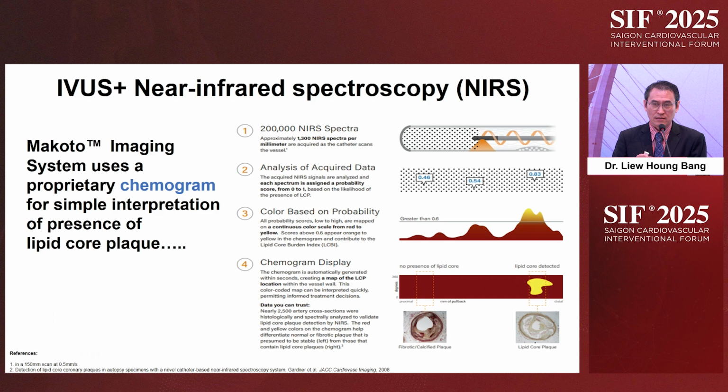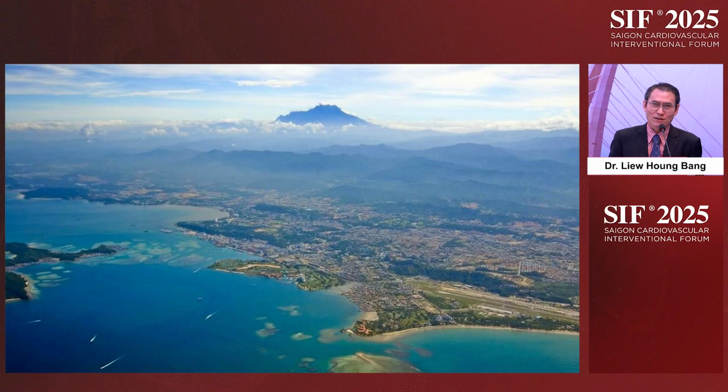It tells us about the arc of the plaque, whether it is circumferential, 90 degree, 180 degree. So it also tells us about the density of the plaque. And this is a concept which is new for us to grasp. And I like to think of it like this.